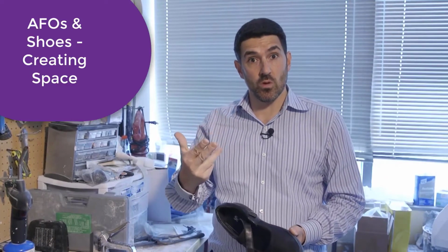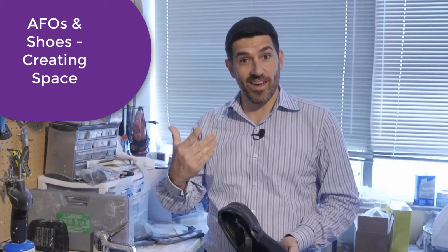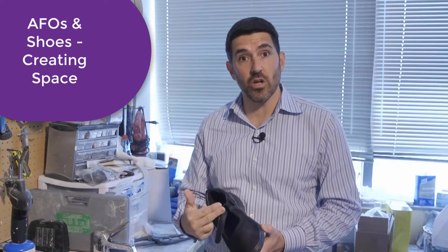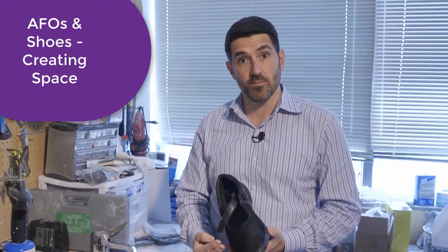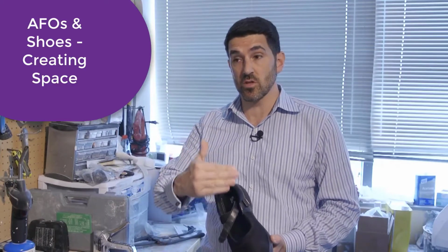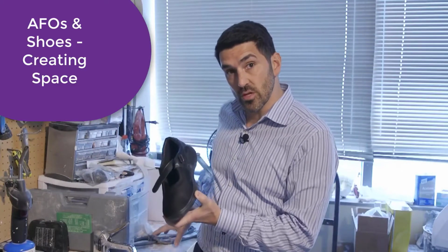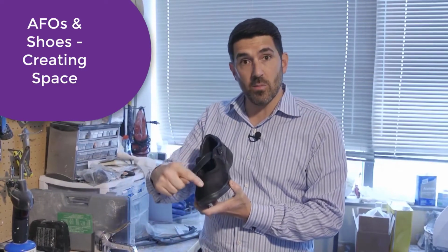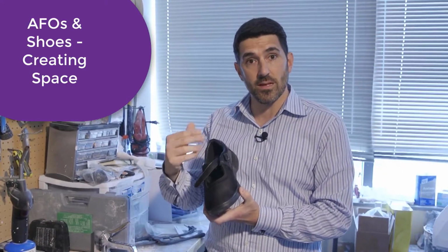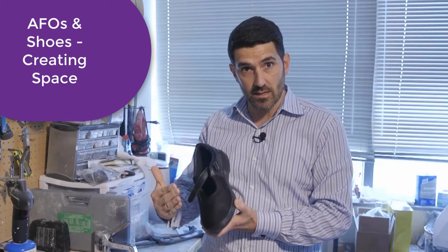You can go to the orthotist. As the medical professional or the patient that's watching this, you can go to the orthotist and have them stretch out that area or multiple areas in the shoe. That might make all the difference for you as a patient or someone who just doesn't want to go buy new shoes. So I'm going to show you this real quick. It is the method by which an orthotist, in many instances, maybe not all, maybe there's another tool out there, can stretch your shoe, which can increase comfort and compliance in activities of daily living as a result.